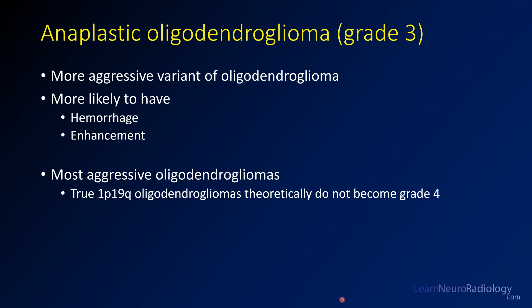This is an anaplastic oligodendroglioma, the more aggressive variant of oligodendroglioma. They are more likely to have hemorrhage and enhancement, both of which we saw in this case. These are theoretically the most aggressive oligodendrogliomas. When patients truly have 1p19q codeletion, they theoretically never become GBMs. If progression to a GBM does occur, something unusual is going on — such as a lower-grade precursor splitting into two clonal populations — but that is very rare.